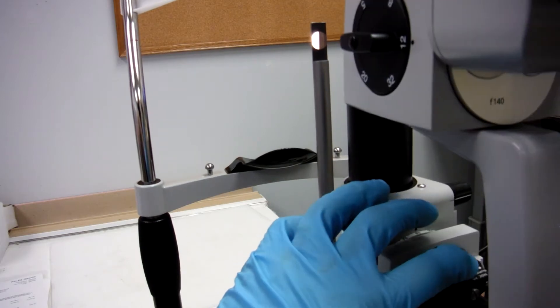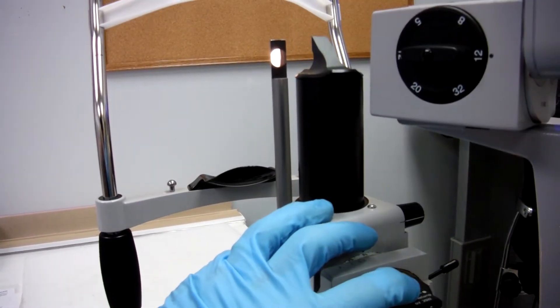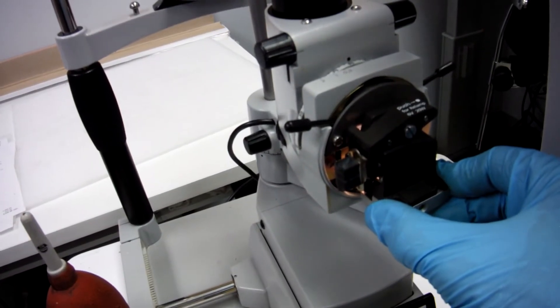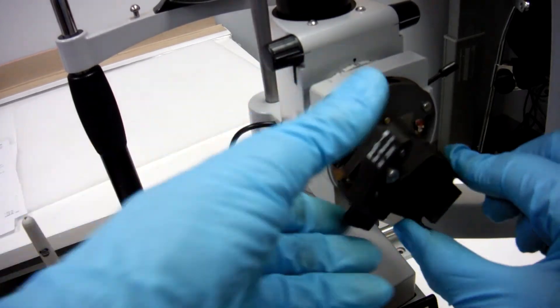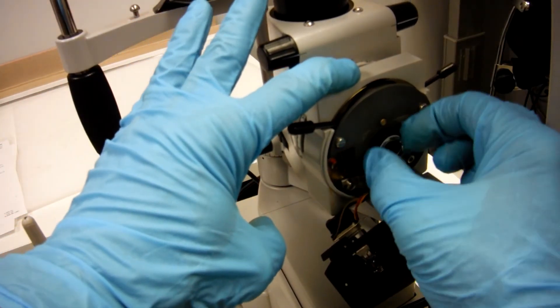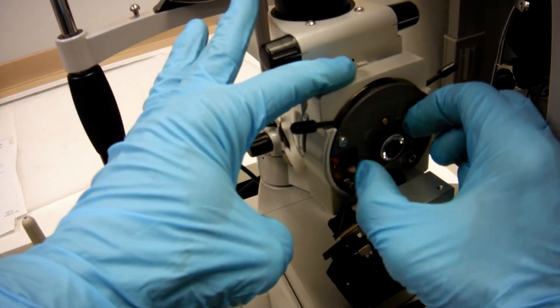Look through your binoculars and see if it's clean. If it's not, you're going to have to repeat the process: turn off the power, remove the condensing lens, and clean it again.